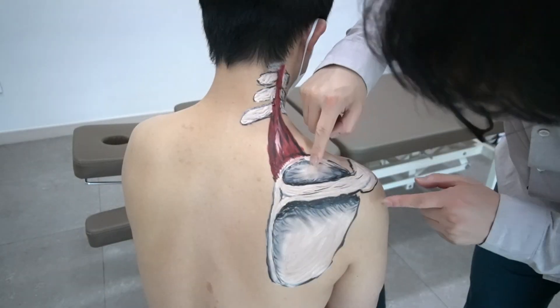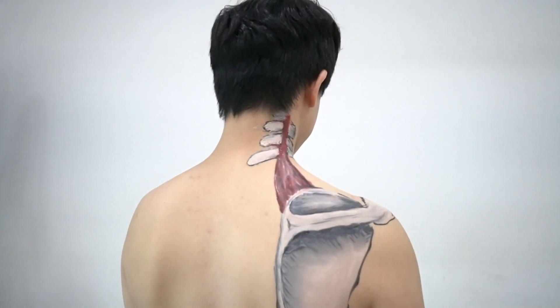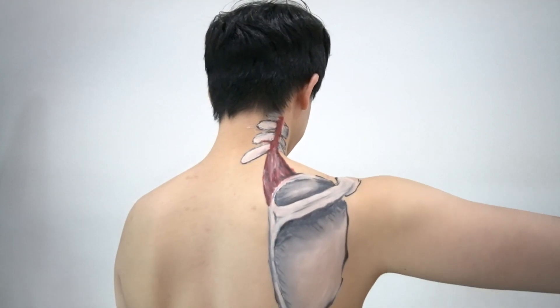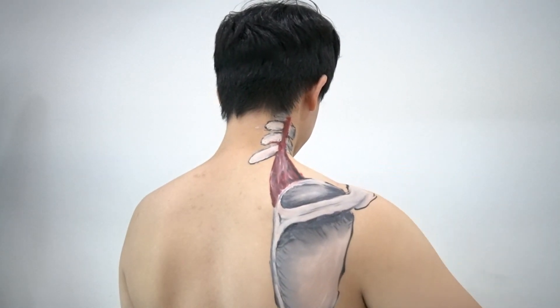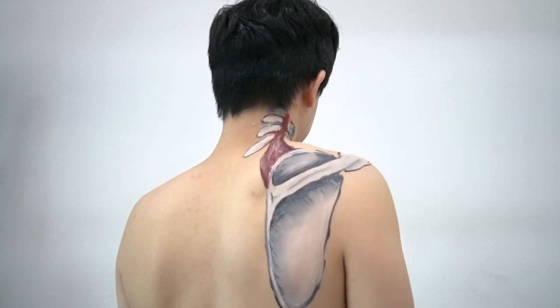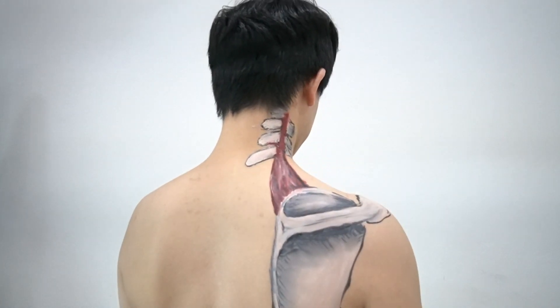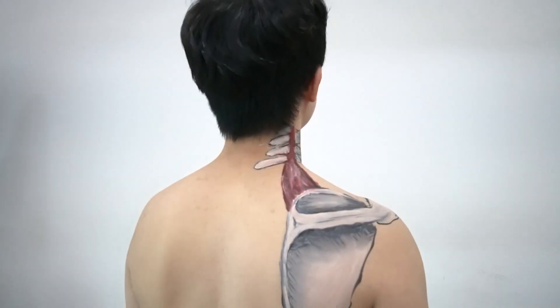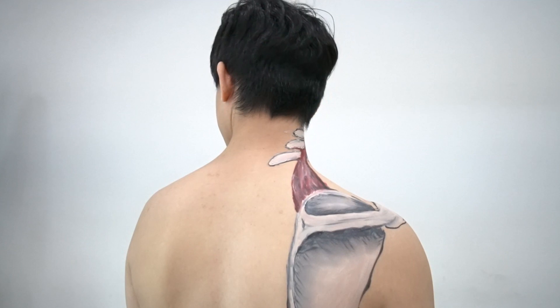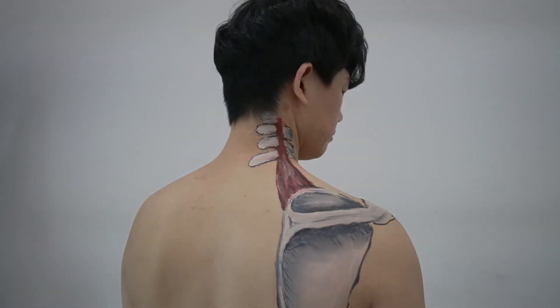Let me show a video that demonstrates the movement of the leviator scapular muscle in different motions. Active arm elevation activates this muscle because the leviator scapular muscle connects the spine and scapular bone.